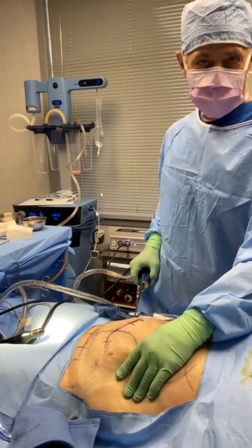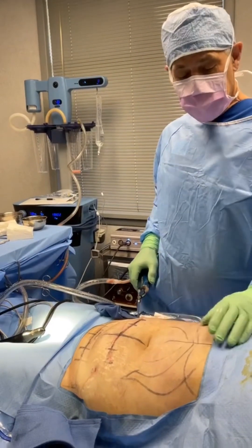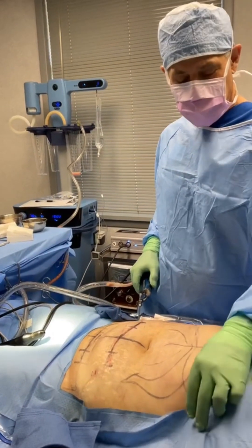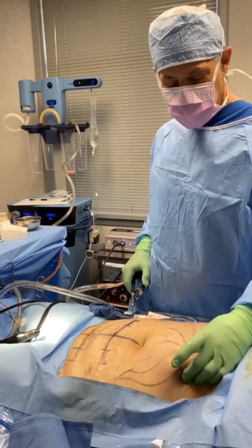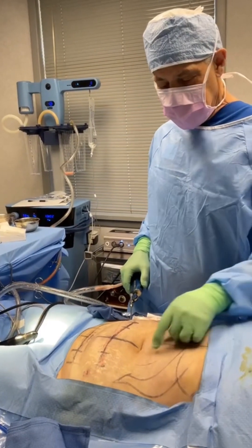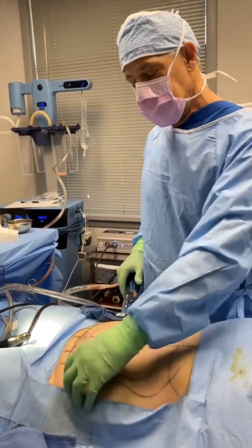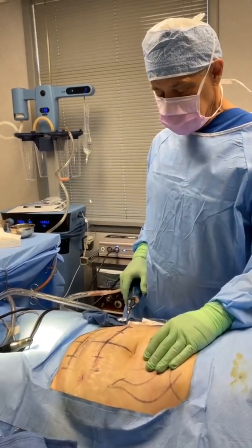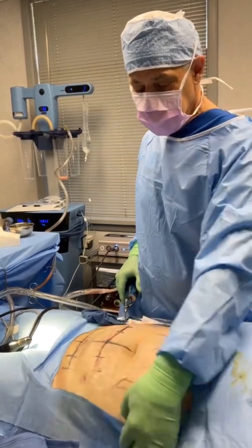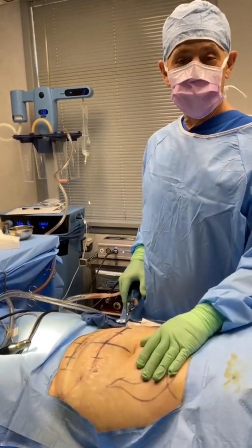So we'll do some sculpting for a while, which means carefully done liposuction, thinking in terms of the contours that I've mapped out here. These are bulges that like to be underneath the breast, so we'll deal with those. Then there's the stuff that likes to be around the belly button — we'll deal with that. And the stuff down here where there's the flap that we'll take out. And then sort of the gutters on the sides here in the waist area. Then we'll move on to the Renuvion.